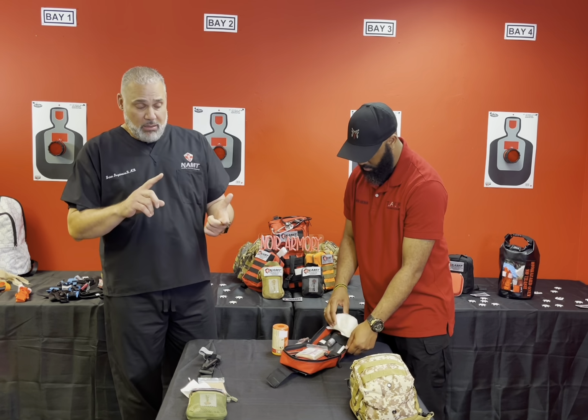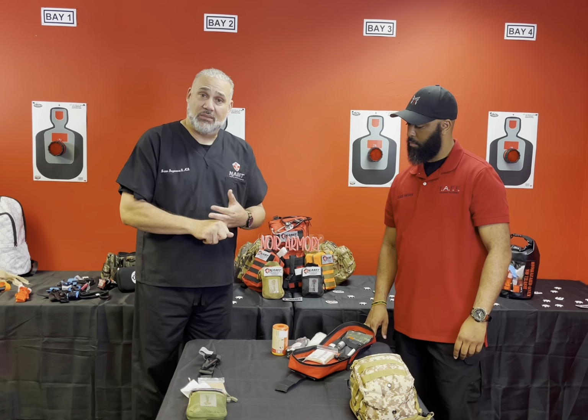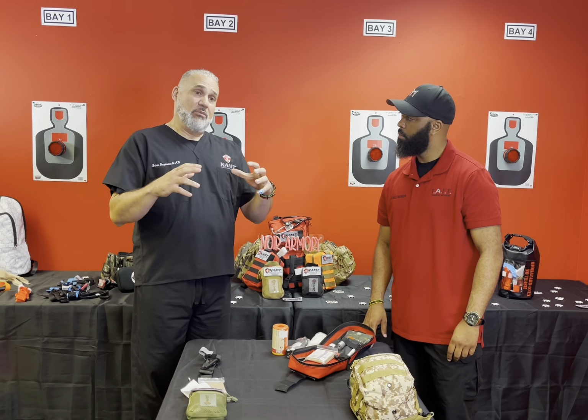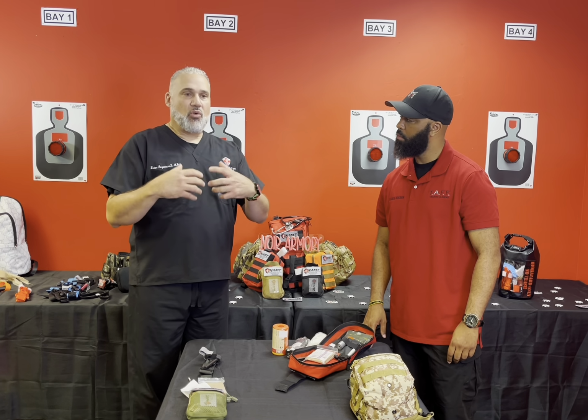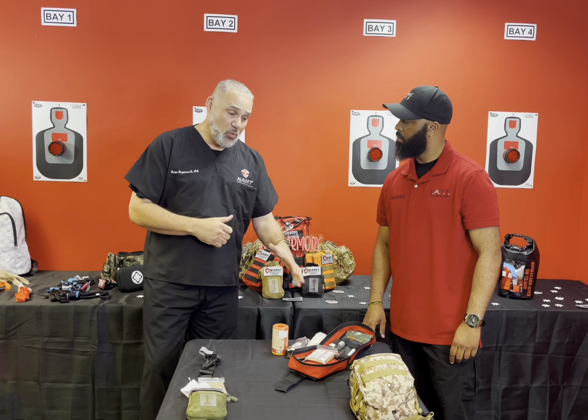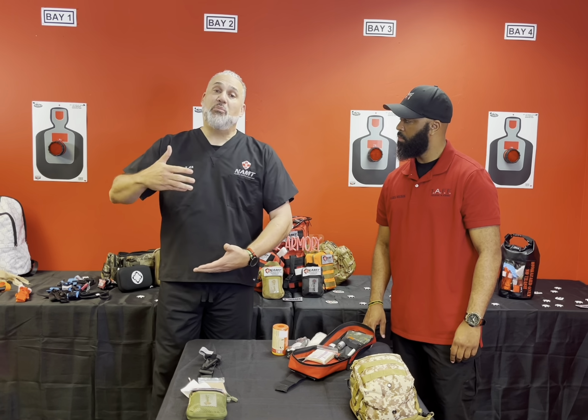We're going to get a roll of tape. We're going to get Celox, right? Celox is a bandage that is impregnated with, for lack of a better term, crustacean shells, and it causes coagulation, which means the bleeding will stop. So it's something you definitely want to use in packing wounds, especially deep wounds. Do recall, we do not pack the box, so we're not going to pack from the neck to the belly button, but they can be used on extremities and can be used anywhere else, neck, axilla, all of those places, okay?